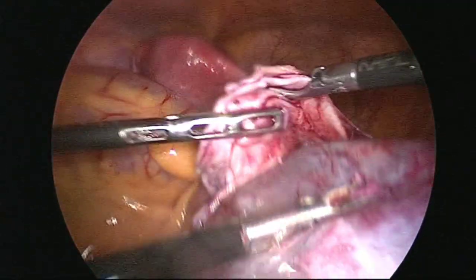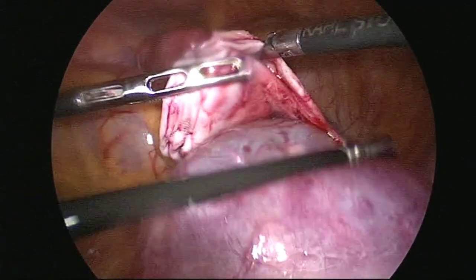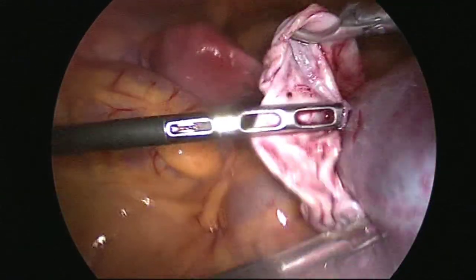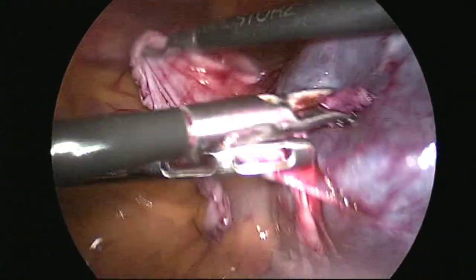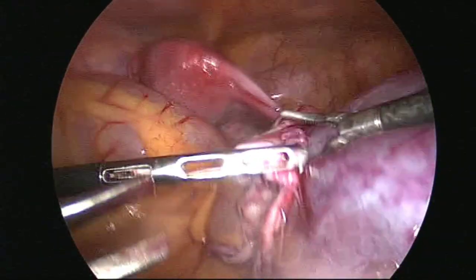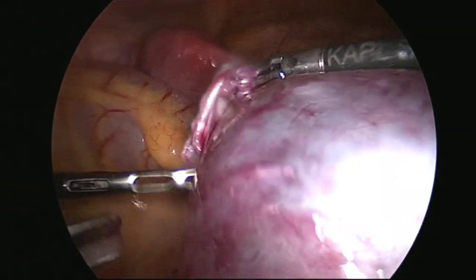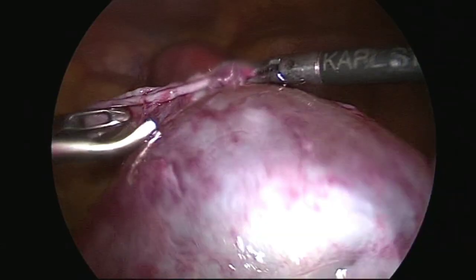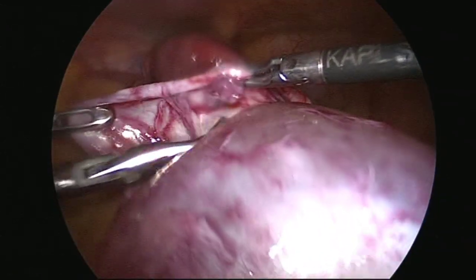For this kind of dissection you need a lot of patience. This is the complete and edited surgery.